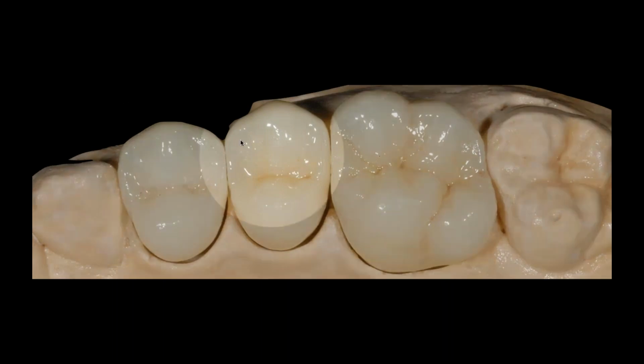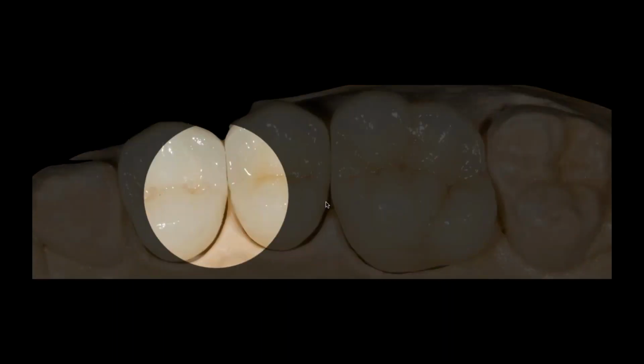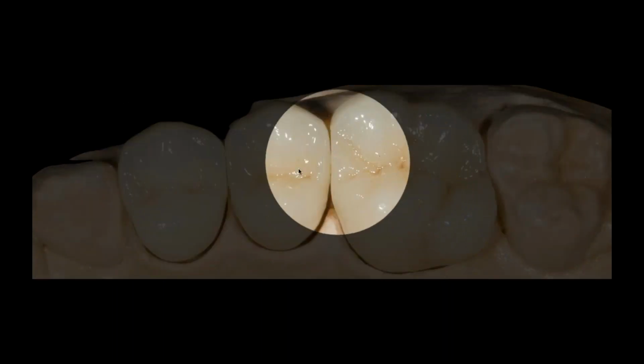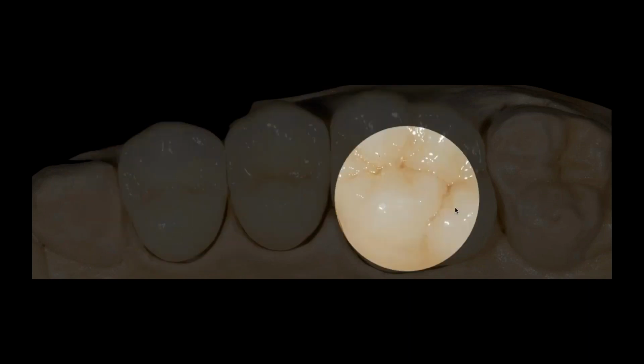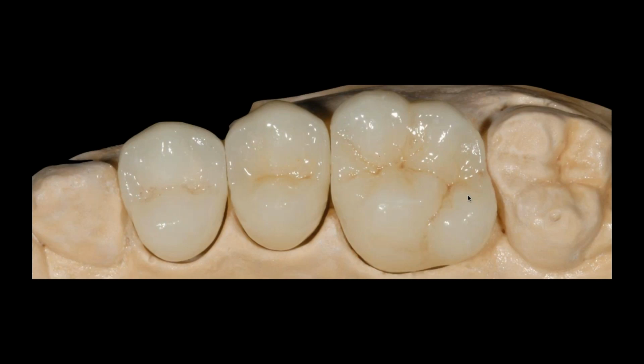And again, look at this from the occlusal point of view. You can see a big difference. I'll put a dot or 2 of stain in there, yeah, but look at the difference in the warmth that's being generated inside the restoration. And that becomes really critical for us to kind of manage through that process.